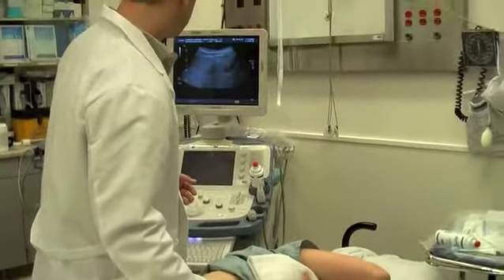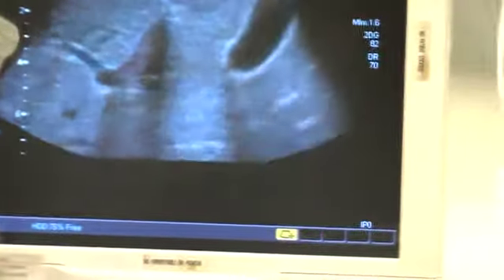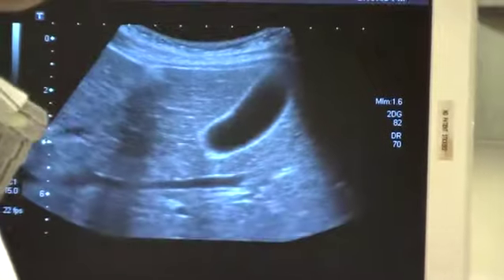Take a deep breath and hold it. So I have a nice little picture of the gallbladder there by getting all my bowel loops out of the way.